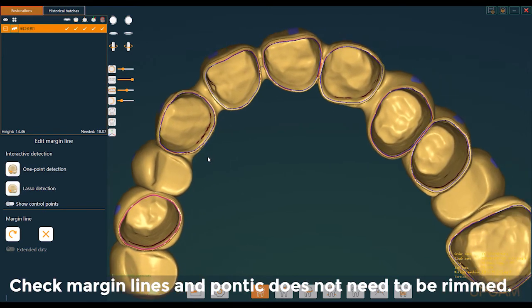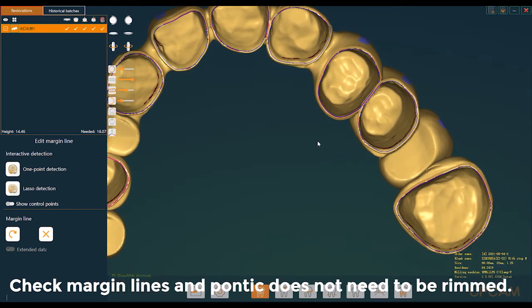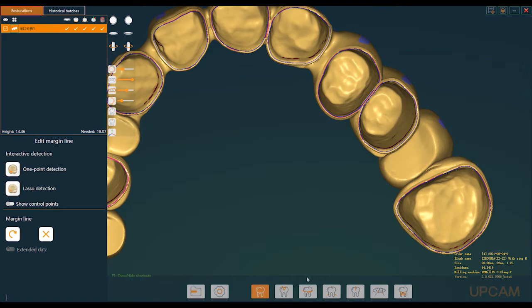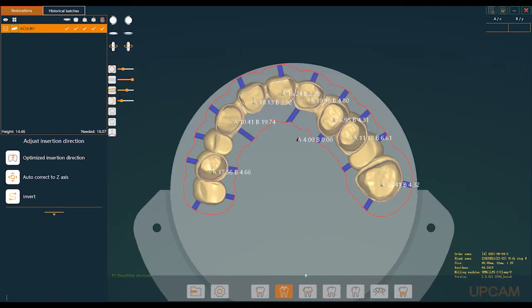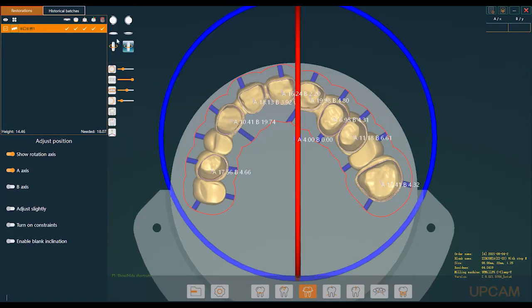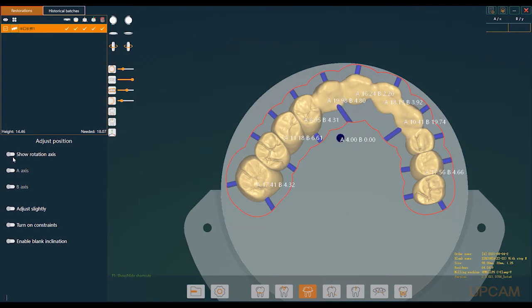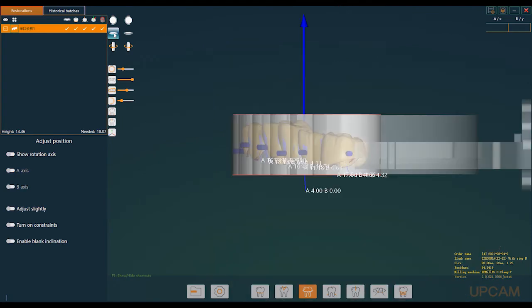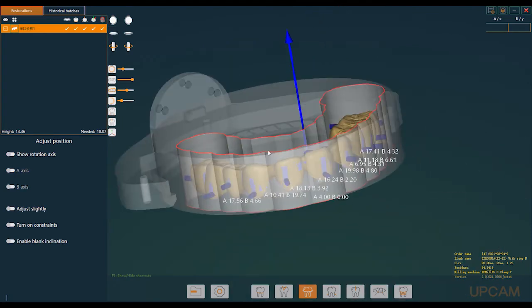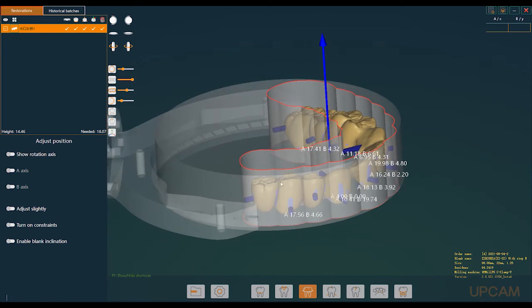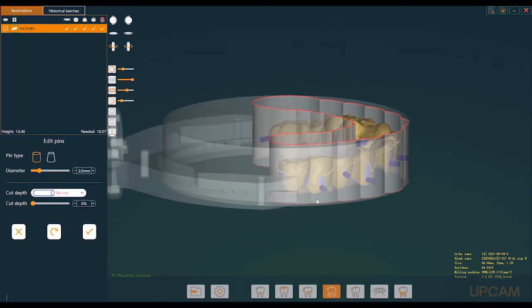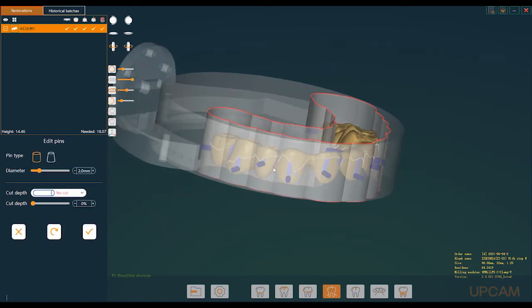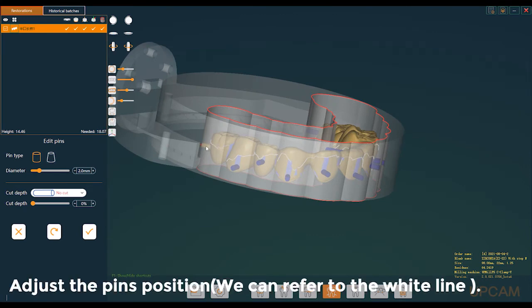Check margin lines and pontic - doesn't need to be removed. Adjust the pin's position; we can refer to the white line.